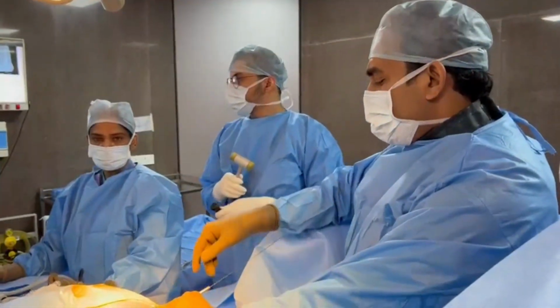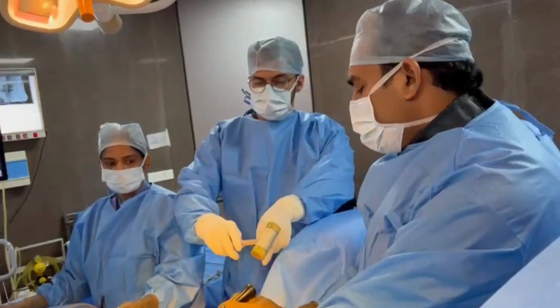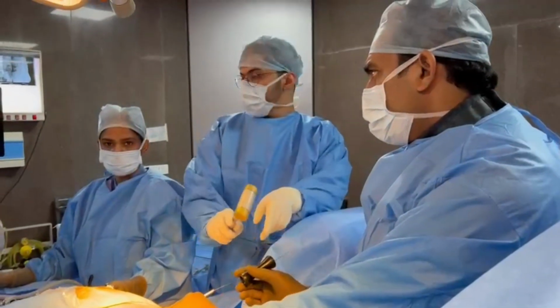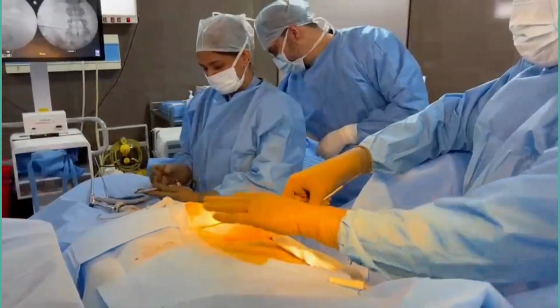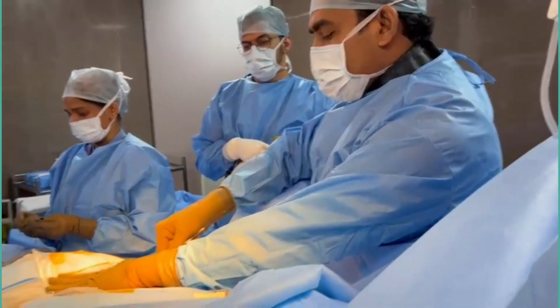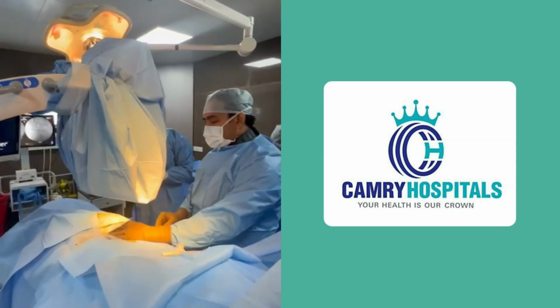We'll just give a small tap. Don't worry, any pain, tell us. Small pain, mild. Repeat. Pain? Little. Little. You're fine? Yeah, I am fine. Okay. Injection? Sure. Okay. So go ahead.